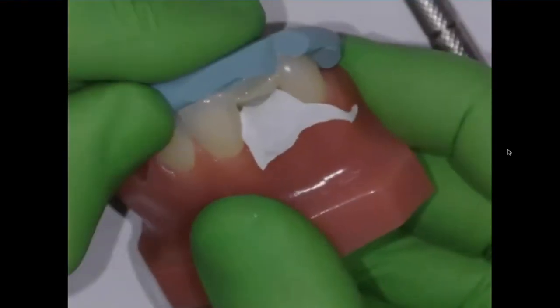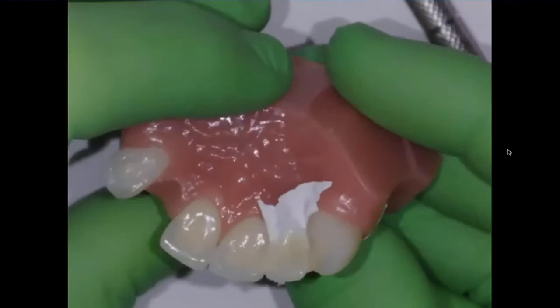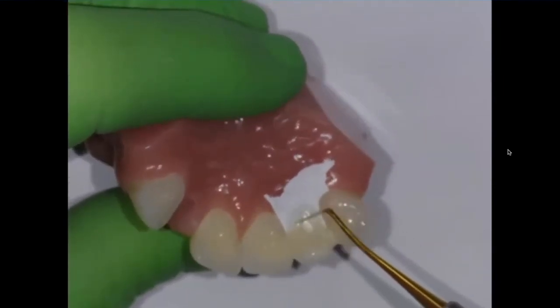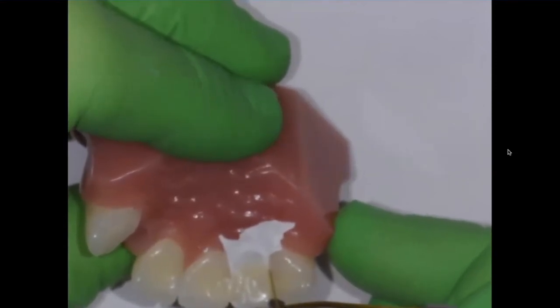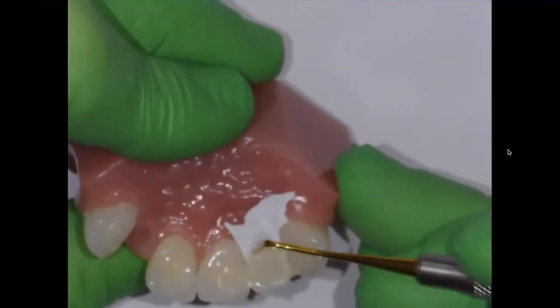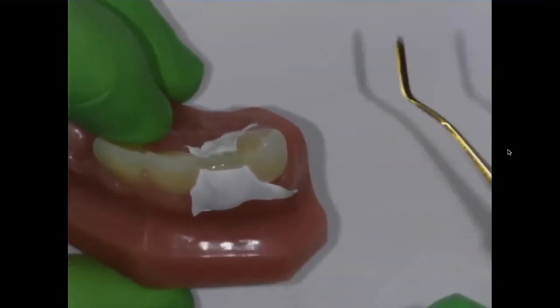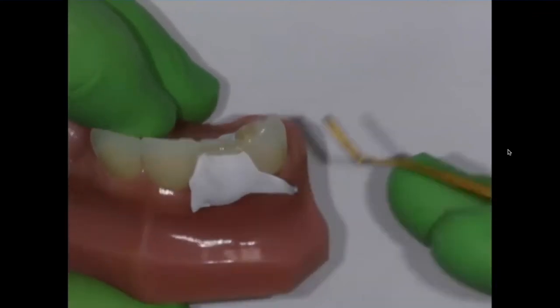I'll gently remove my putty matrix. I can see my palatal wall. I'm a little underdeveloped towards the cervical, but I can add a little composite into there. At this point I can make sure that my embrasures are open and that I don't have any excess flowing into there. So now we have that palatal wall created, and then we're going to come in and do the mid body, build into the Teflon tape, and then save room for our facial composite.